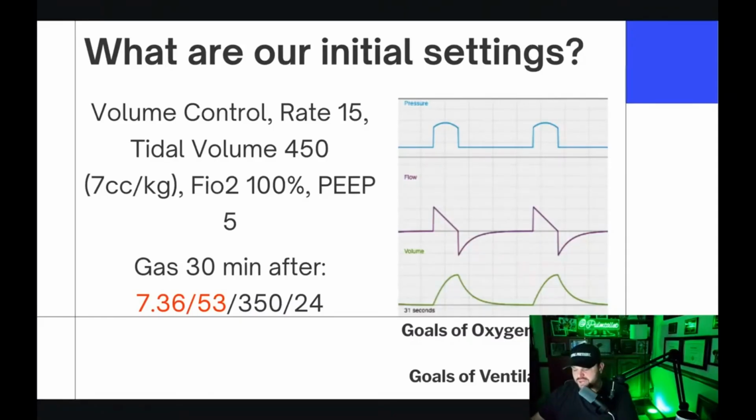Why that's important is when we talk about work of breathing on the ventilator: if the patient's sick, you want the vent to do most of the work, but you don't want the vent to do all of the work, because then you induce diaphragmatic dysfunction. Diaphragmatic dysfunction increases your time on the ventilator. It makes weaning more difficult. I think there's increased mortality. So all this bad stuff. So I want the patients to do at least the trigger work, the work of breathing to trigger the ventilator.